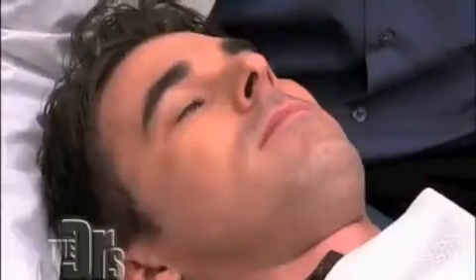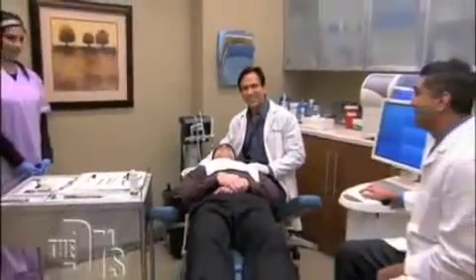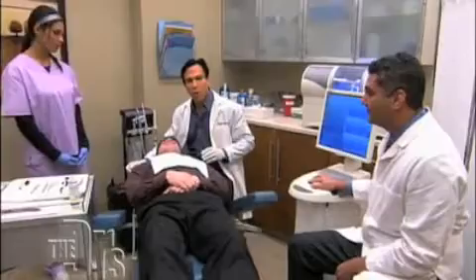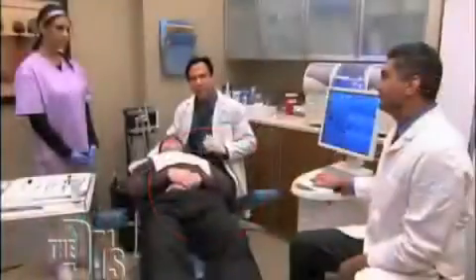We have your patient Kevin here, and also with you today is dental assistant Krista and dentist Dr. Armin Mirzion. Kevin broke his molar eating popcorn, and what we're going to do today is make him a CEREC crown.